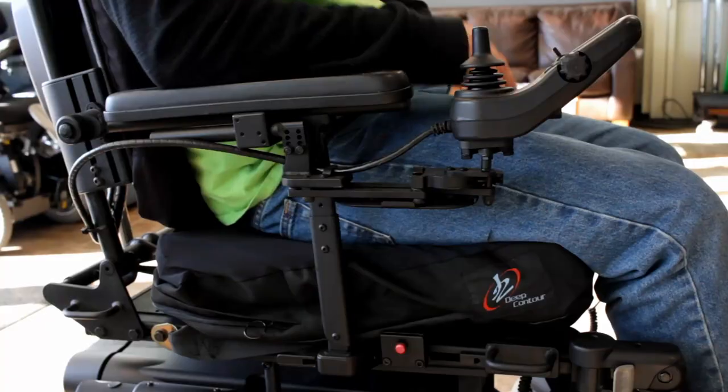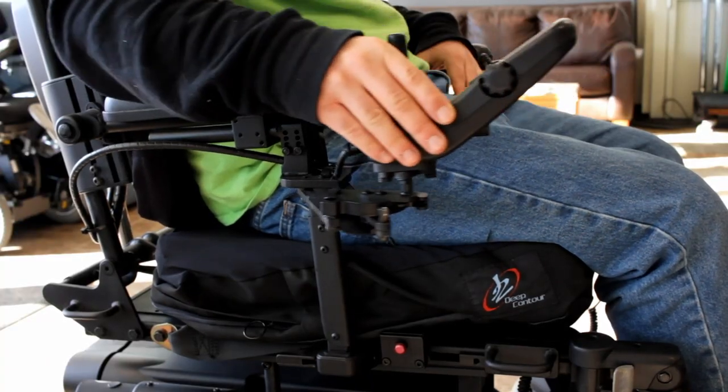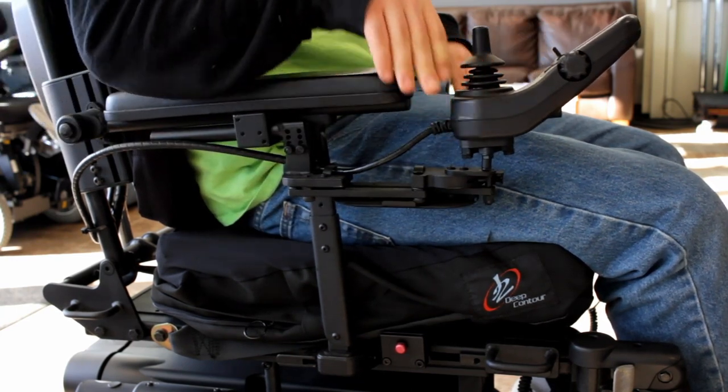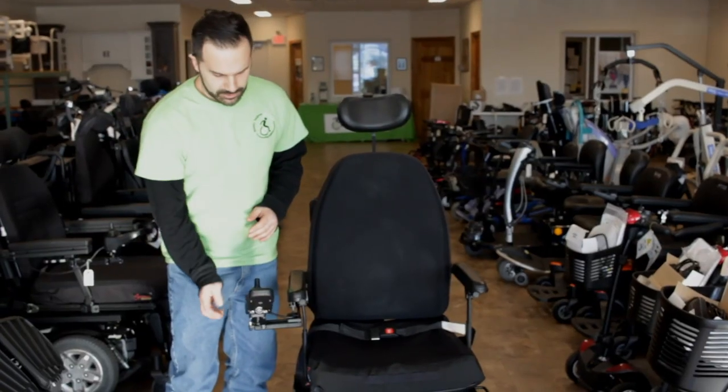Something to highlight would be the swing-away joystick mount. They can actually sit right in here, pull up to a dining room table, and get as close as possible using this.